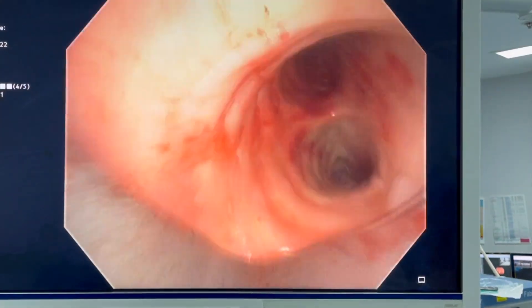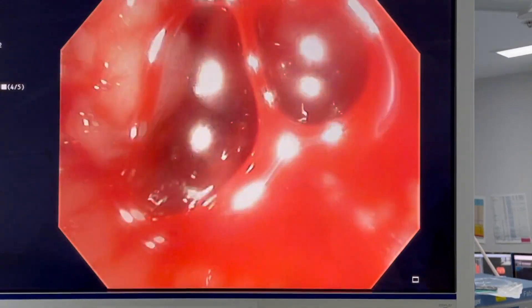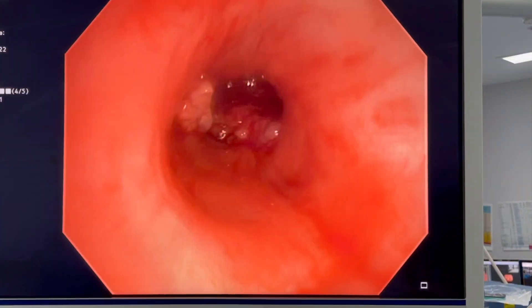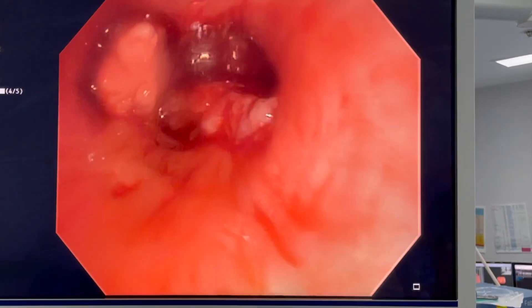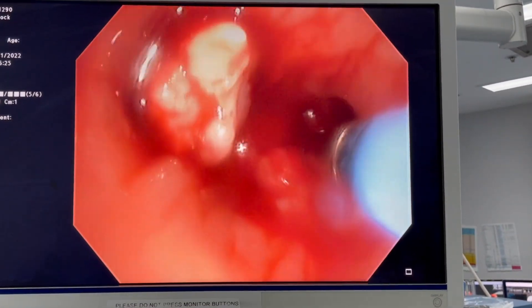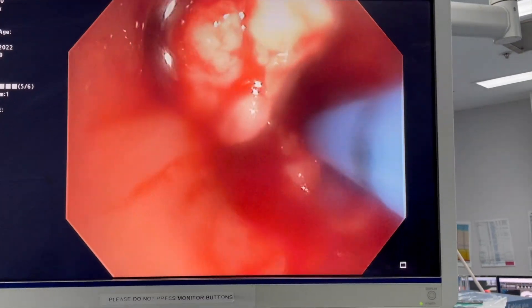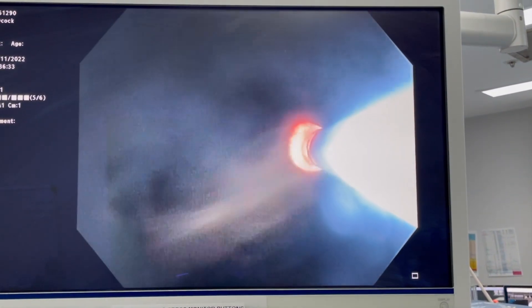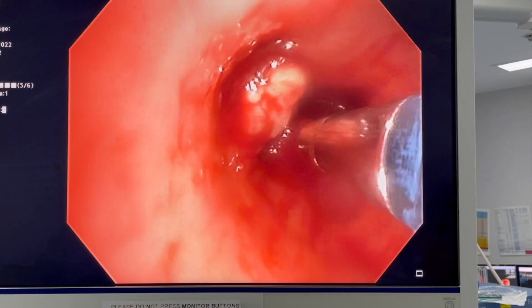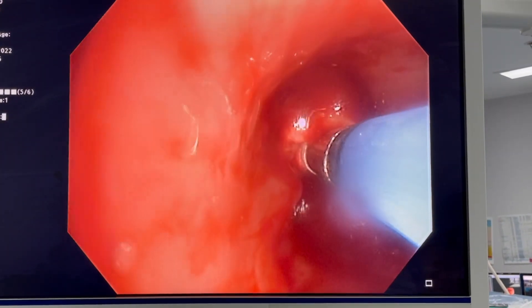Now I'll have a look to see how things look now that's been resected. There's a little bit of blood around but not too much. You can see there's still residual tumour, but we've removed a large amount. I'll use the cryoprobe again to remove more of that tumour, trying to clear as much away to achieve a patent middle lobe and lower lobe. Here's the cryoprobe again — it advances to the tumour, freezes, and grabs onto pieces so we can remove bits. Not quite as big as the first piece that we snared and cut through, but it removes tumour quite quickly and safely. Once again using the cryoprobe to grab a bit of that tongue of tumour — it freezes and we can remove quite a big piece.